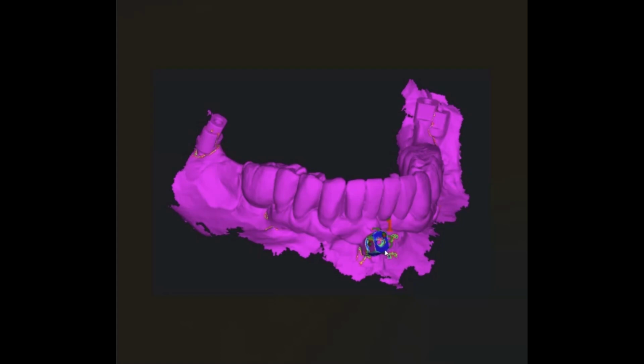What is that going to tell you? That's going to tell you that you're going to create a first provisional that has excellent alignment, midline, cant, plane of occlusion, all that. You're able to design in such a way with high confidence that you're going to get a good result. Now, contrast that with what you see in the back in there too. You see diplopia, you see double vision, you see 2 different scan bodies. In this case, they're particularly very divergent.